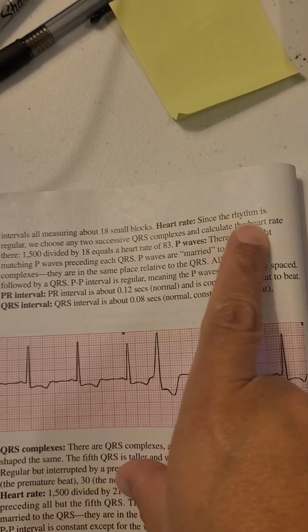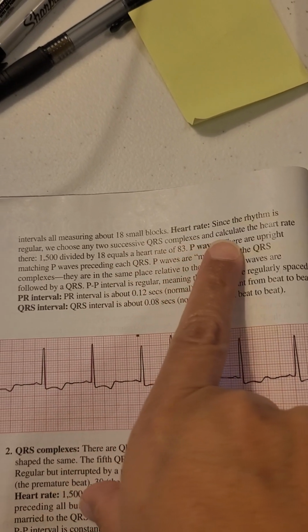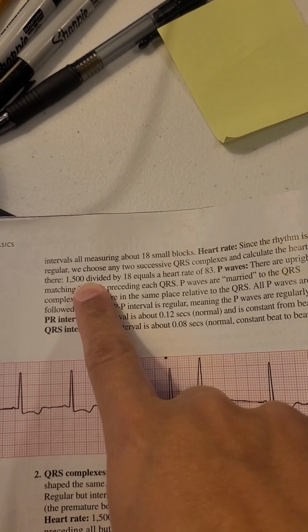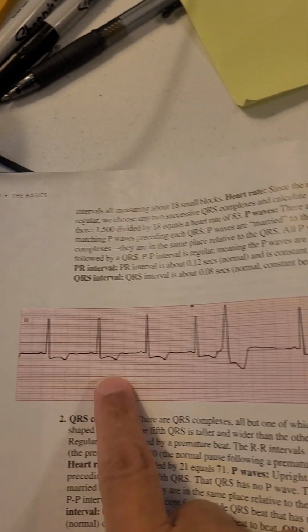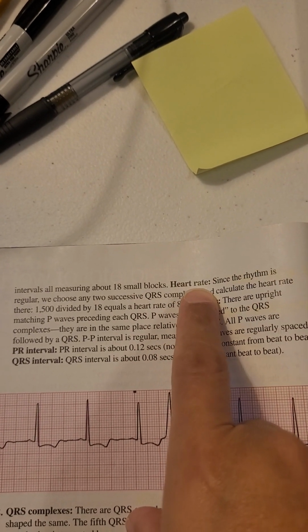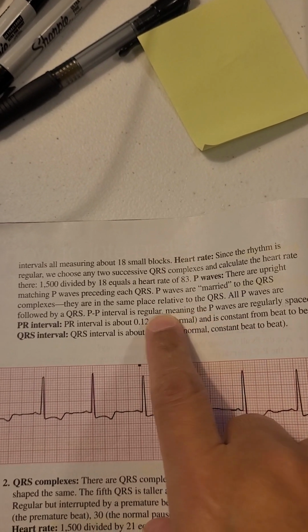Heart rate, since the rhythm is regular, we choose... Okay, well, we're not going to do that. There are two other ways to measure heart rate, but they're a little harder compared to just counting each one, so we're not going to do the heart rate. We're just going to do the average. That's how I'm going to show you.